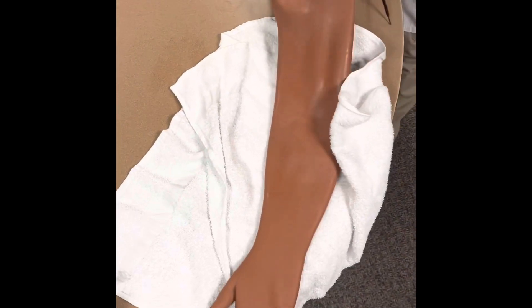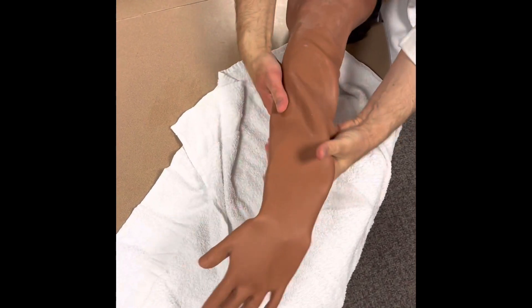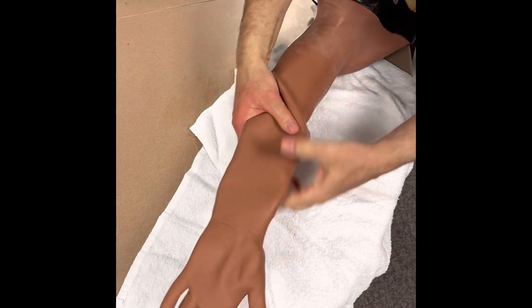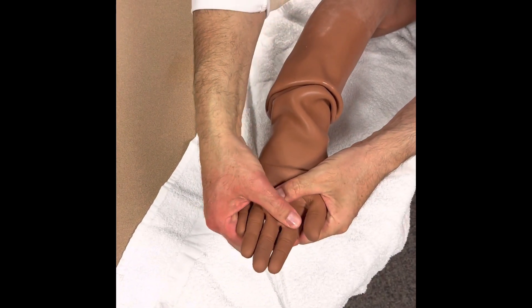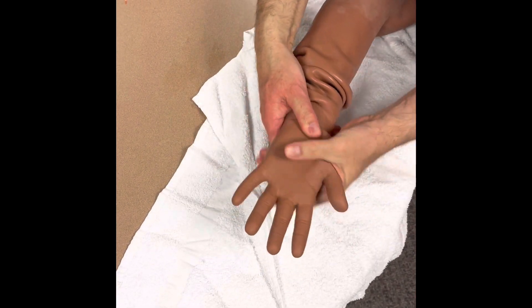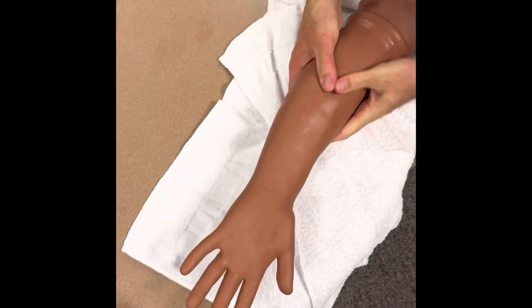I'm going to slide the hand in — make sure you get it on the first time. As you're guiding the skin on, you want to make sure to stop at the point where you can feel the fingers, and then start slowly guiding it on with the fingers in their correct locations. Then just pull the skin up nice and tight.